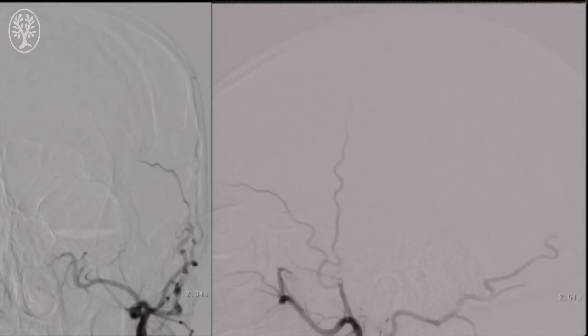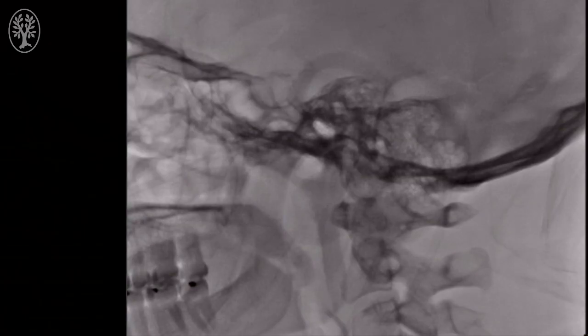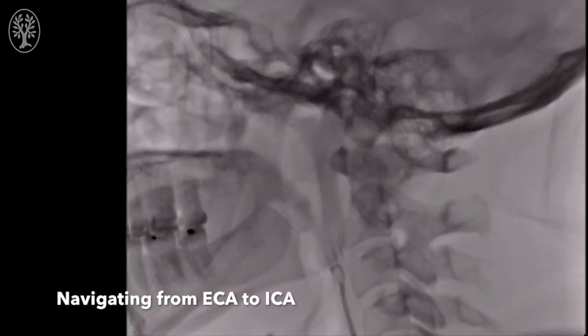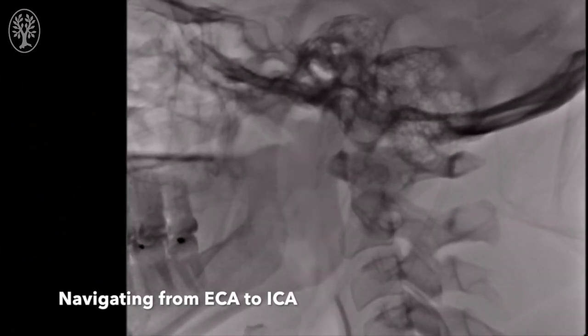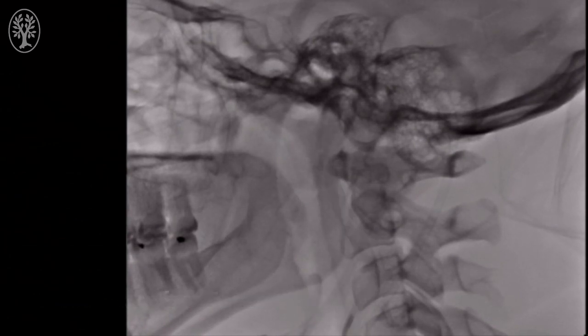A left external carotid artery injection is obtained, again using slow, constant pressure to opacify all. We want to assure filling of the occipital branches, which we see here. The catheter is then withdrawn using puffs of contrast into the common carotid, at which point the internal carotid may again be selected and the catheter advanced with twisting movements to avoid dissection of the vessel.